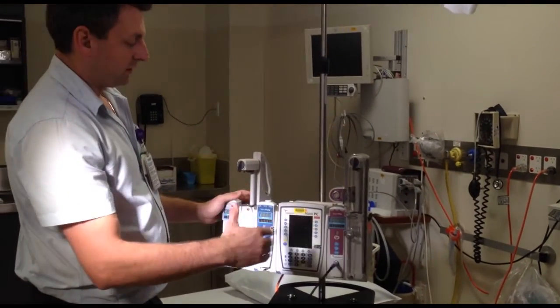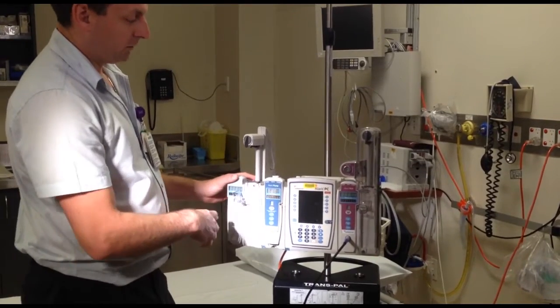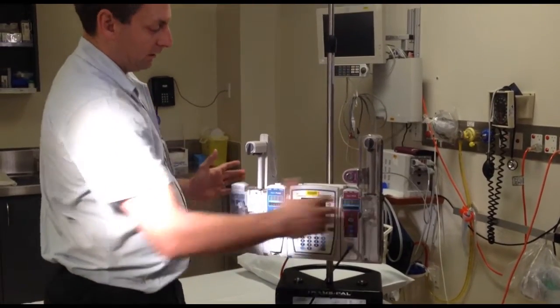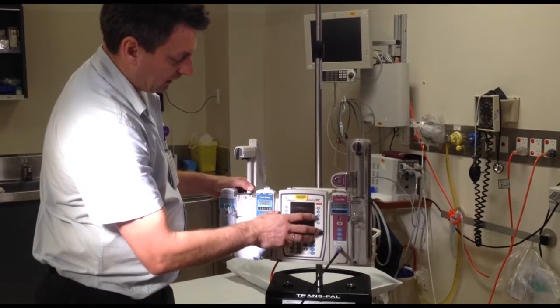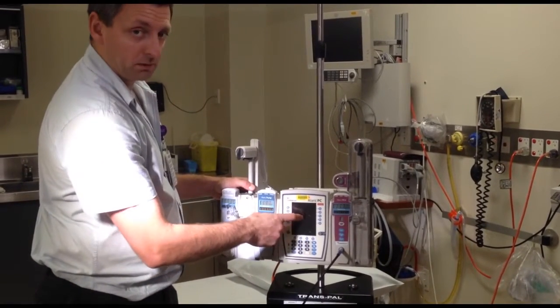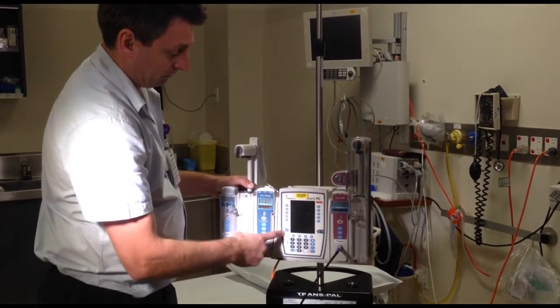That's the module system — it can take four modules, so you can put another syringe driver or LVP on it to make four. There are buttons on the front. The actual screen isn't a touch screen; you have to soft press these keys on the sides and down the bottom.